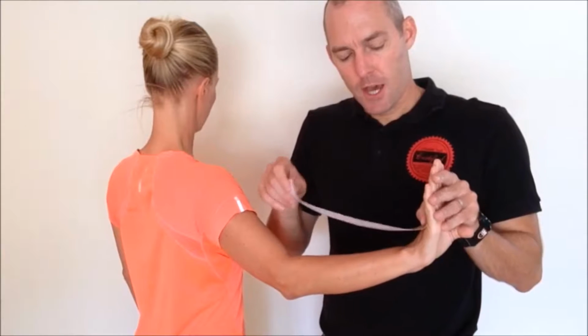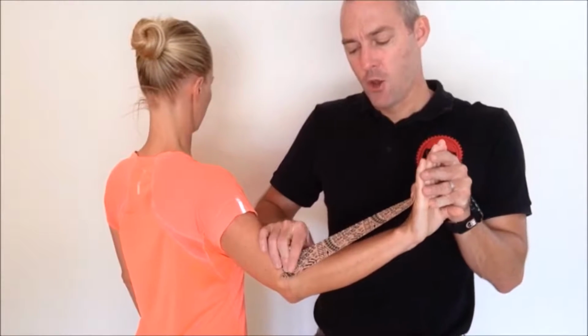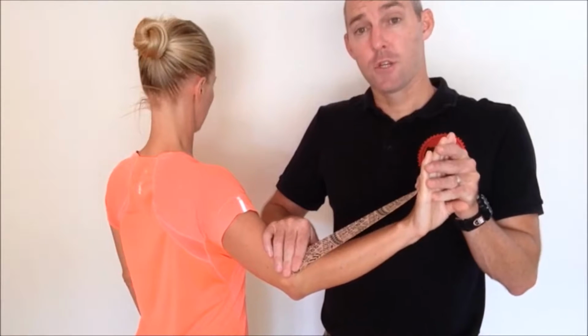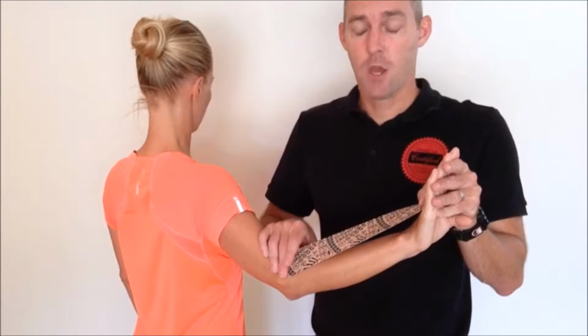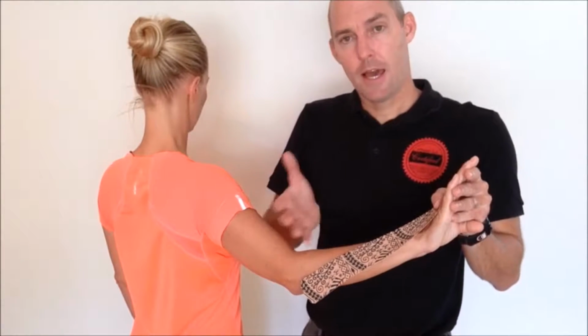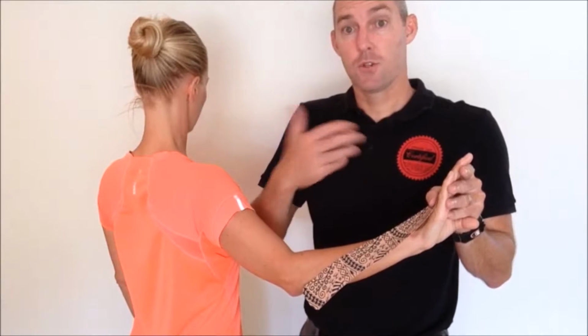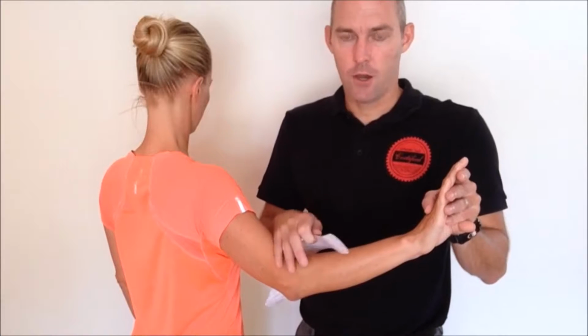So if we just start at one anchor point and we stick our other anchor point on first before we come down, what we're really doing there is focusing all of our tension, all of our force and pressure on those anchor points. So if we do that, we're more likely to get a reaction, or we're more likely to have the tape come away because of that 10, 15 kilograms, 25, 35 pounds of force going through it.